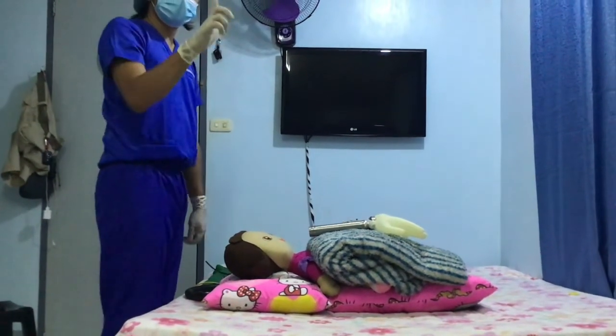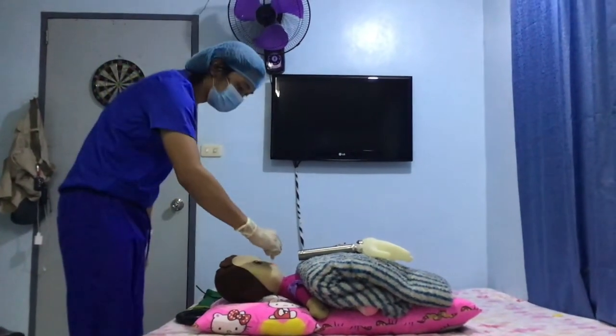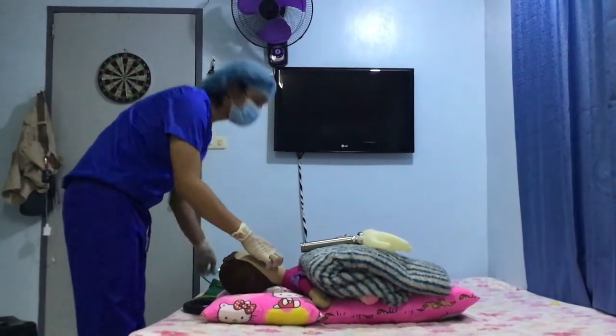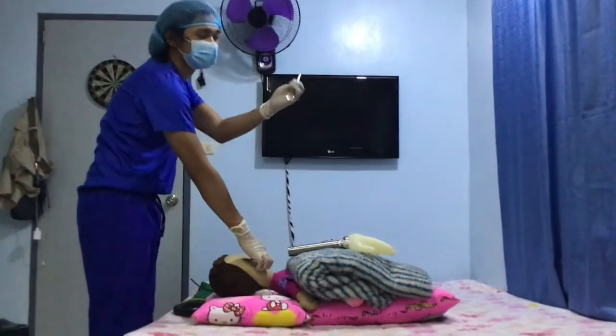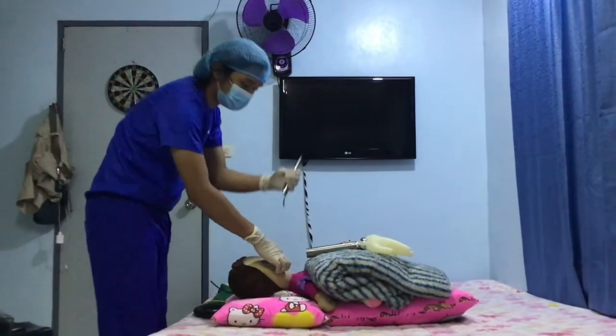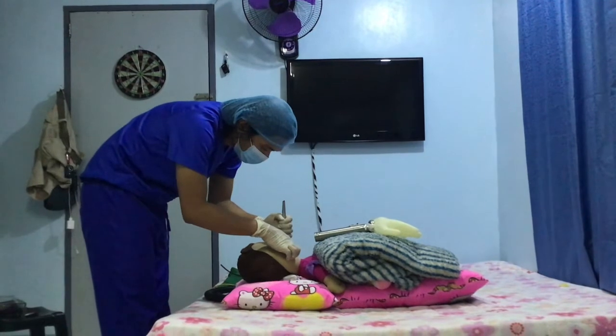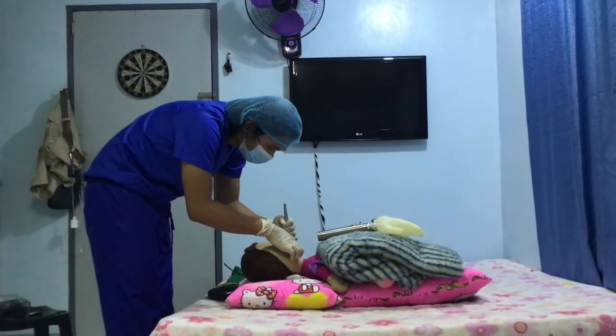Scissor your thumb and index finger to open the mouth. Hold the laryngoscope with your left hand and the blade may be near the finger for better position and control. Enter at the right corner of the mouth, then sweep the tongue towards the left. Advance the blade further until the vallecula.